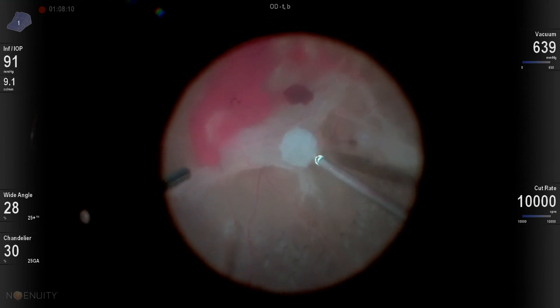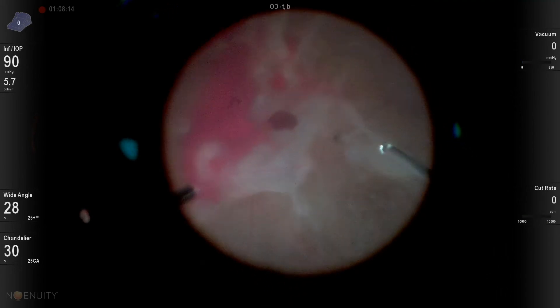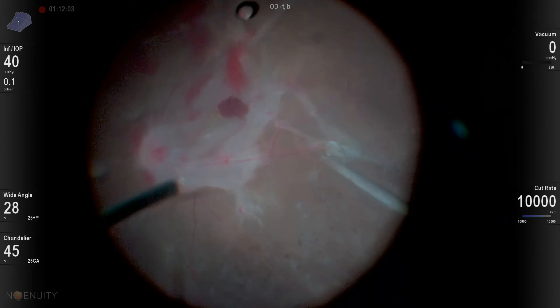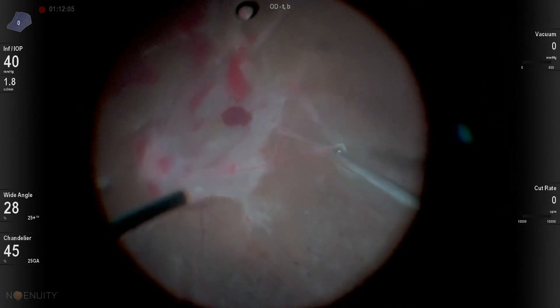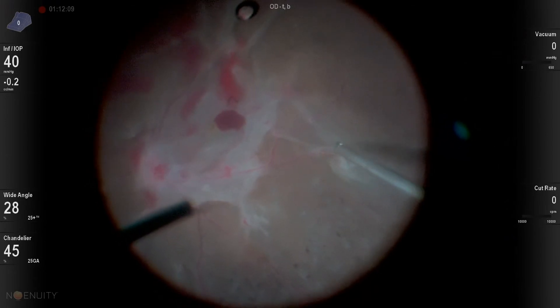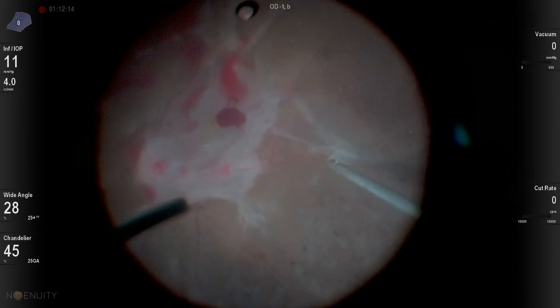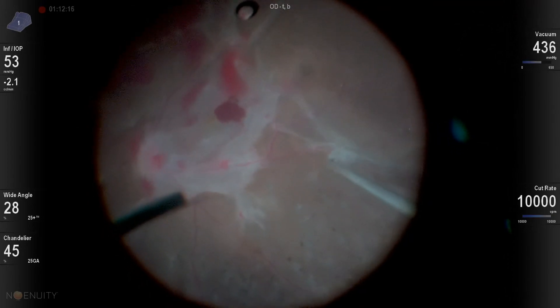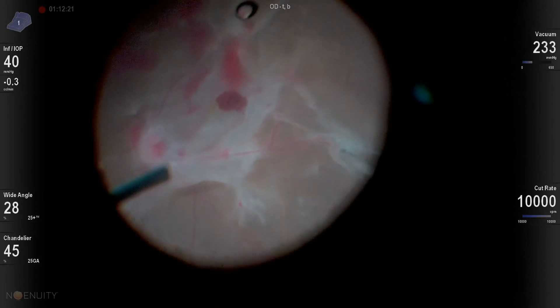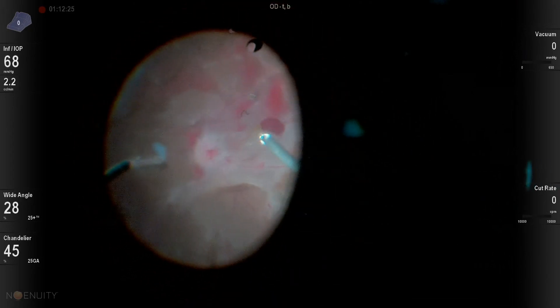Look at how beautifully this cutter removes that fibrotic tissue while leaving the underlying retina intact. This is that last little piece, and it's always the last little piece that gets you. I probably should have just left this alone, but I was determined to get this area up. A very dangerous move here — I put my cutter face down and cut against this fibrotic tissue. I would not advise this. I simply got lucky that I didn't do any damage to the underlying retina.